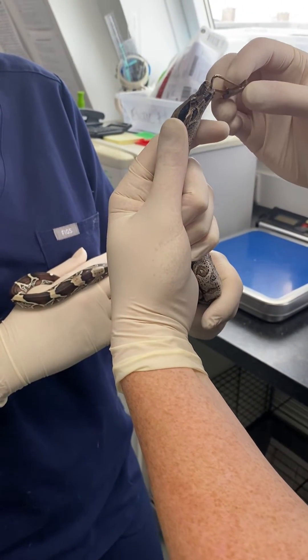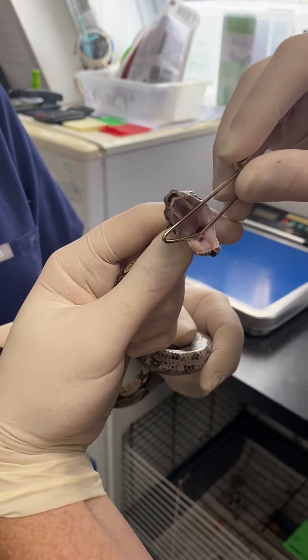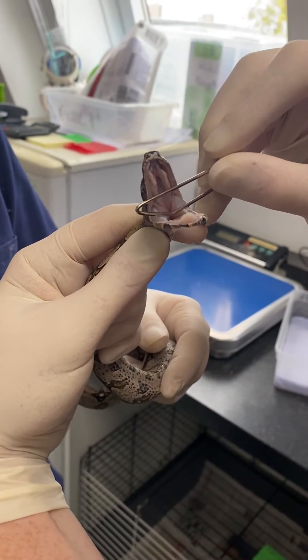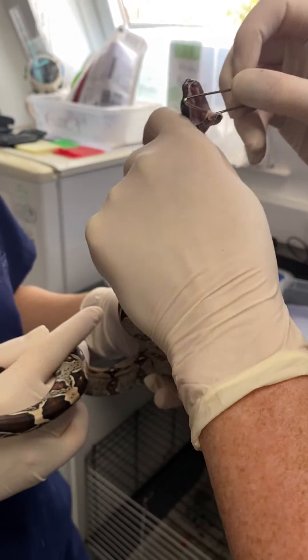We just want to gently slide this into the mouth. What you can see is at the base of where there is a kink on this gag — this is where the airways open up. He's holding his breath at the moment — there you go, opening up quite nicely, so we are going to hold this in place.